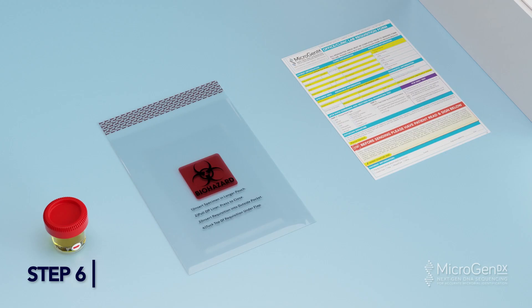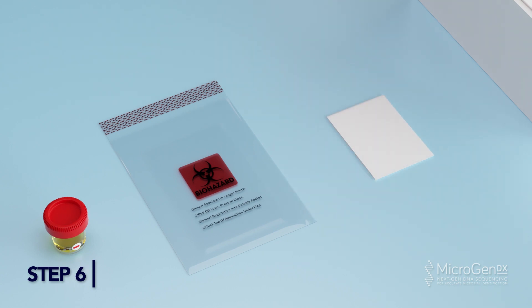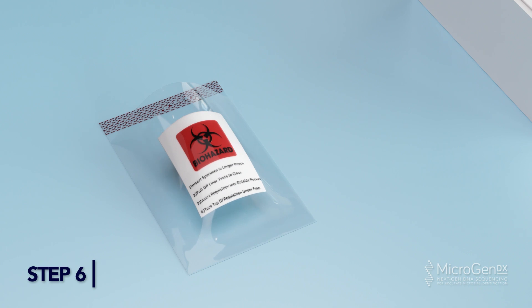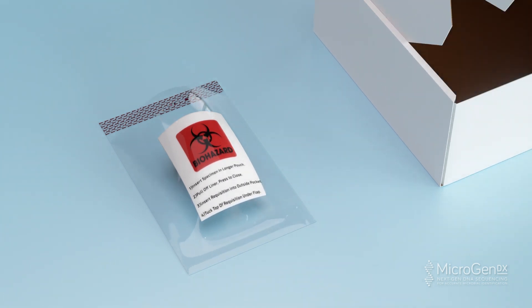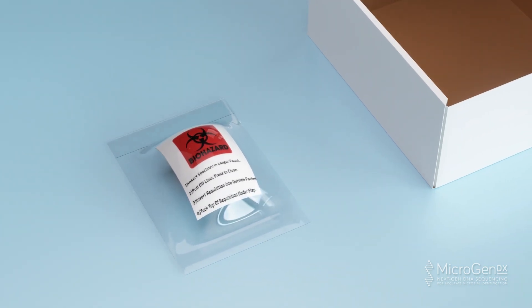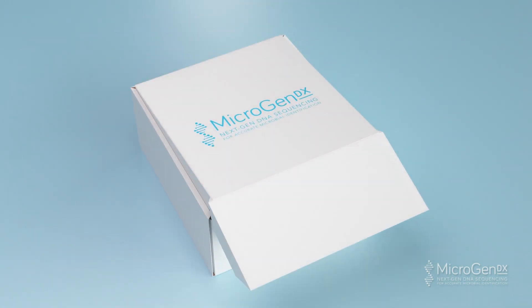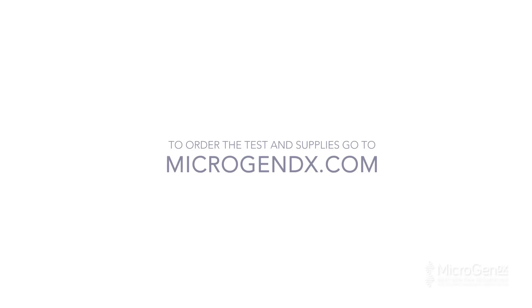Step 6. Place your completed MicrogenDX lab requisition form in the front pocket of the bio bag. Place the 90ml collection cup inside the larger pocket of the bio bag. Peel off the adhesive strip and press to seal the bag. Place the sealed bio bag into the MicrogenDX prepaid shipping box and ship out according to your facility protocol. Alternatively, take to the nearest FedEx drop box.